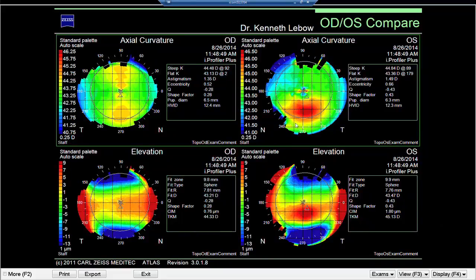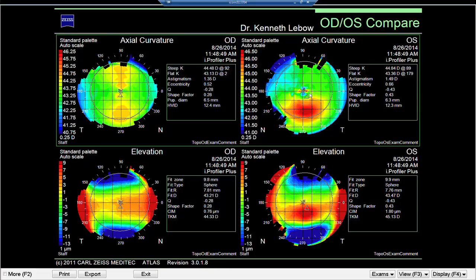But if we compare the left eye to the right eye, you should notice right away that there's a pretty red spot on the bottom of the axial map of the left eye. The astigmatism is about a diopter and a half. From pattern recognition, this should tell you there's superior flattening and inferior steepening — one of the hallmarks of keratoconus.